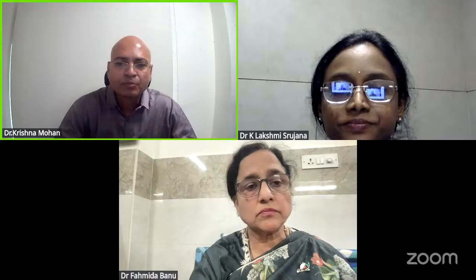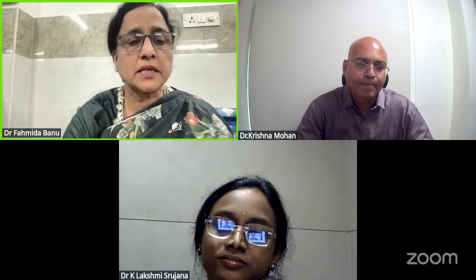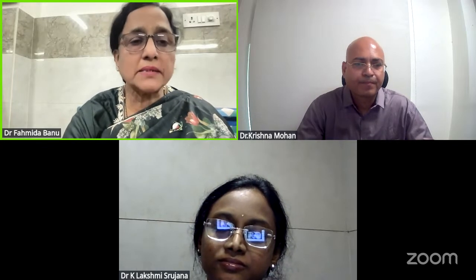One more question, madam. What are the most common diagnostic pitfalls in imaging-based identification of endometriosis? In ultrasound or MRI we report a few lesions, but during surgery or laparoscopy you find multiple lesions. That means there are a lot of pitfalls in imaging also. That is very true. As I told you, the symptoms, the imaging, and the visualization at laparoscopy may not match in every case. With the advent of 3D, 4D, and detailed MRI description, many findings are matching, but not always.